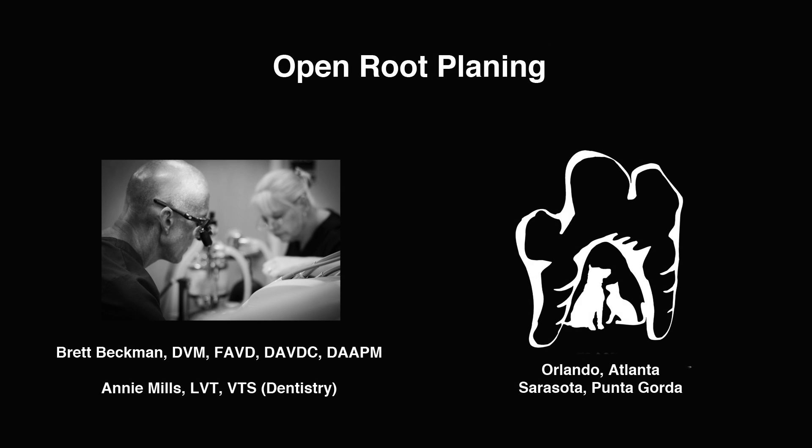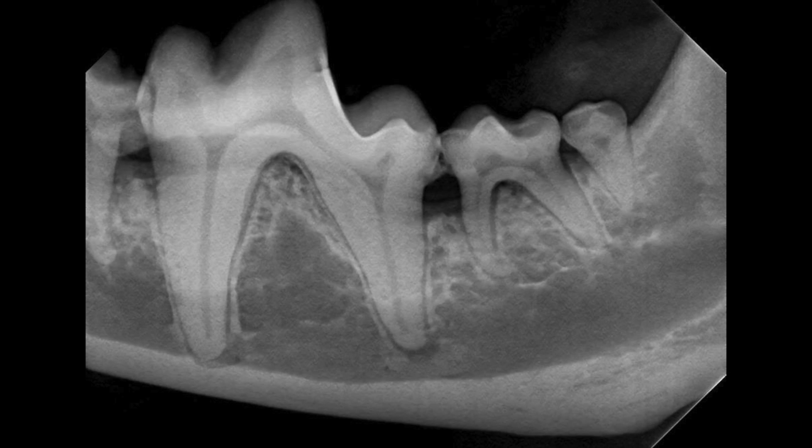In this video we're going to demonstrate open root planing in an eight-year-old dachshund that has adjacent defects to the mandibular left first molar.